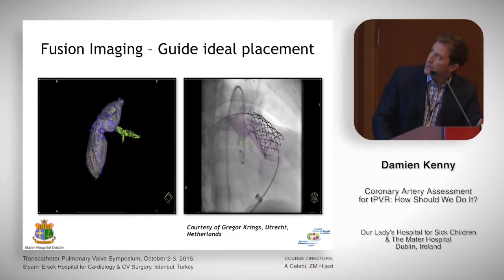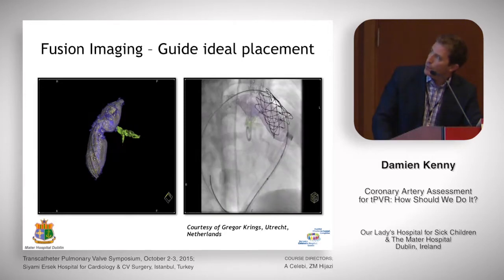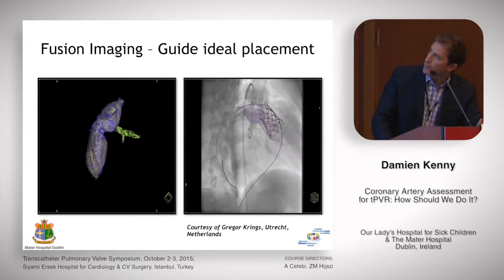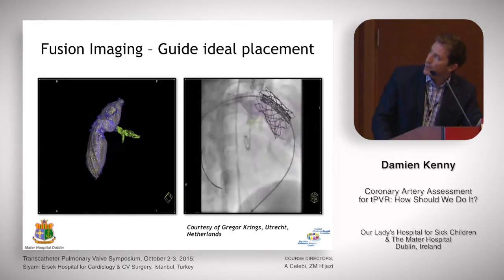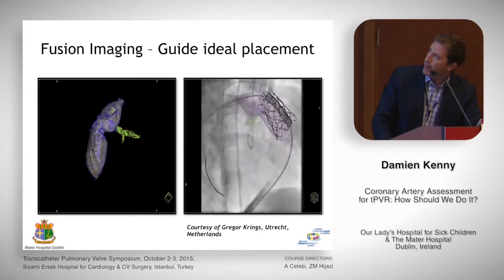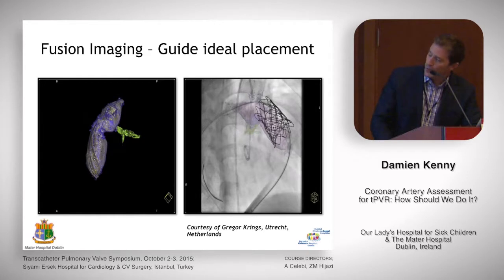It's probably a CP stent, I think, that's been put in. And then again, always evaluating the position, and then post-dilating, and then eventually going up with the Melody valve to deploy the percutaneous pulmonary valve. I see some flaring just at the proximal portion of it there to help you get the valve up, because again, there's some room distally for you to be able to do that. And even though this is at 10 times the speed of normal, it's still taking a little bit of time to go. But anyway, I won't delay on it.